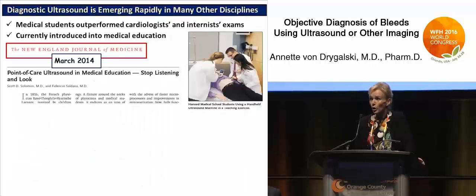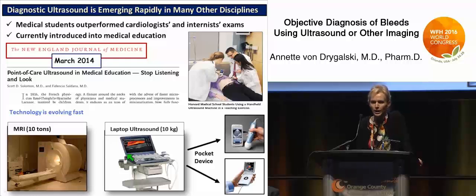So now that you know what the ultrasound can do for you, it's important to realize that diagnostic ultrasound is emerging rapidly in many other disciplines. And this is just an opinion piece from the New England Journal of Medicine 2 years ago, demonstrating that medical students trained on those little pocket ultrasounds outperformed cardiologists and internists' exams. And so these modalities are currently introduced into medical education. And you see, we have come a long way from MRIs to laptop ultrasounds and now to pocket-held devices, and I want you to hold that thought to the end.